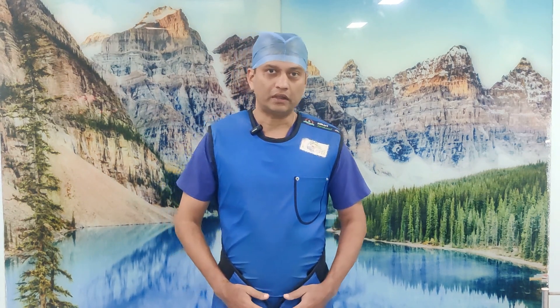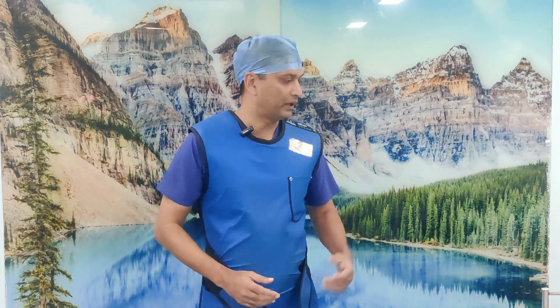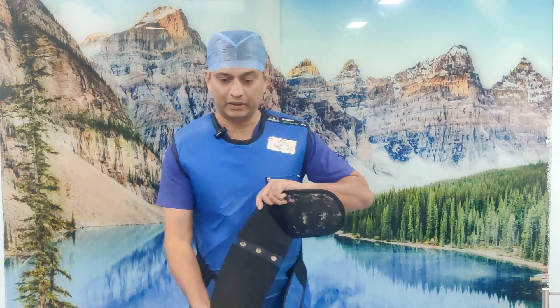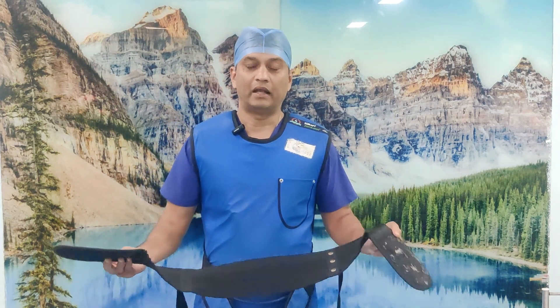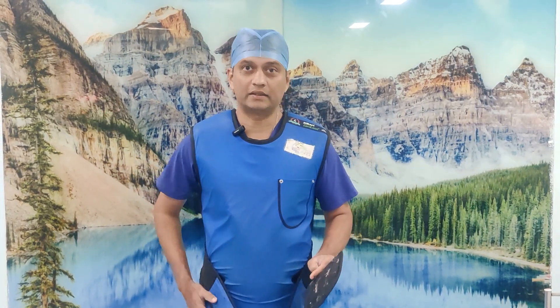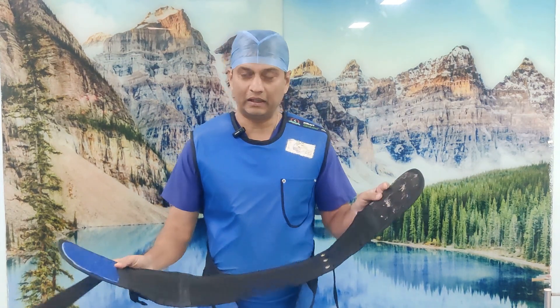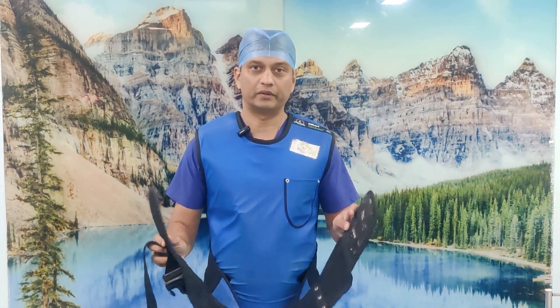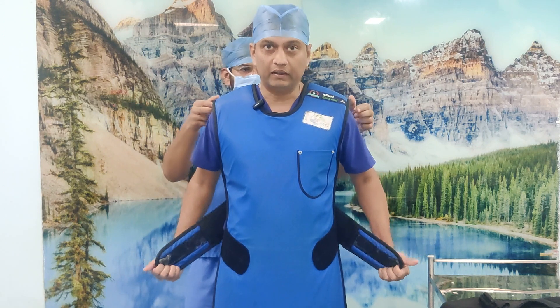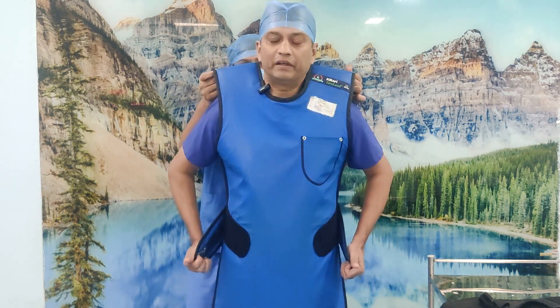But the best way, if you have an assistant, is you can ask them to raise the lead apron. The second thing you require when wearing a lead apron is these belts. These belts are provided for a reason. If you are just wearing the apron without this belt, it's all wrong. If you don't have this belt, order them because it's going to change your life. Now Akash is going to lift it up for me.